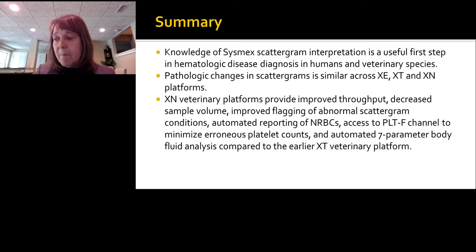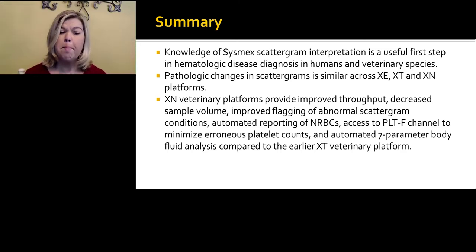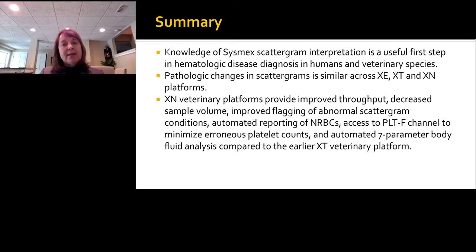Thank you, Dr. Criswell. Our next question is, what is the benefit of having the ability to set your own WBC differential gating? All right. So we saw one example where they actually reanalyzed a sample. That's one advantage: if you can really see how it's separating, you can go through a reanalysis and still obtain your data.